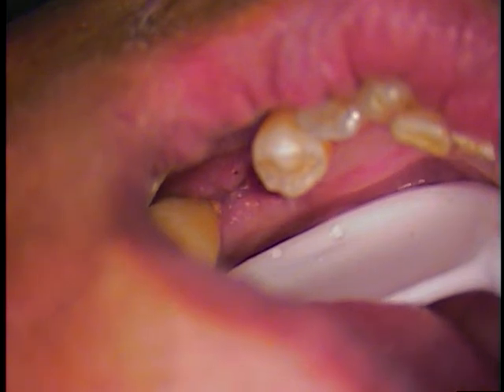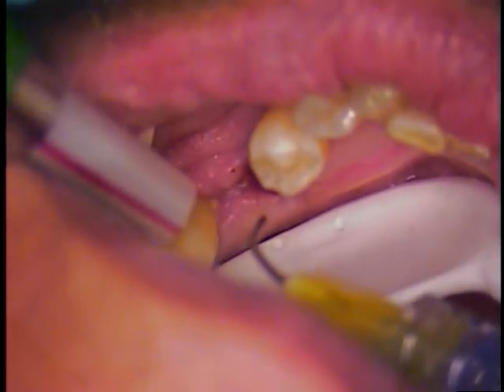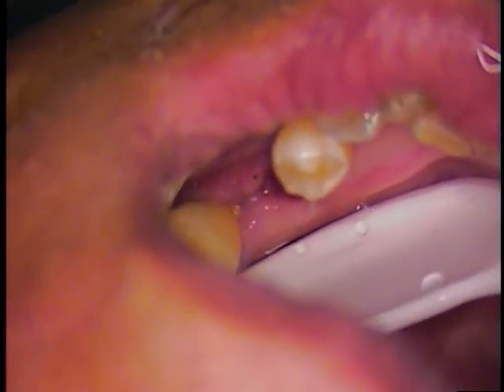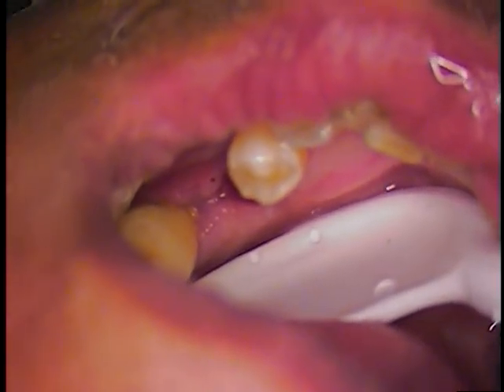And we're going to come in. We may be leaking a little bit on you here. Don't worry, you'll get a little wet. Turn on suction. We're going to get you a little wet. Let me change this one out. We'll put a different one on there.